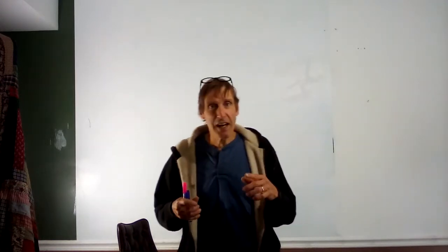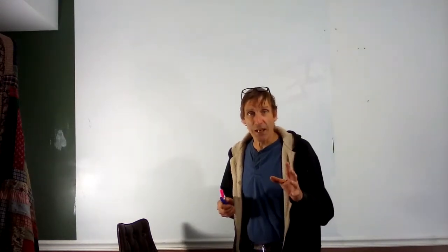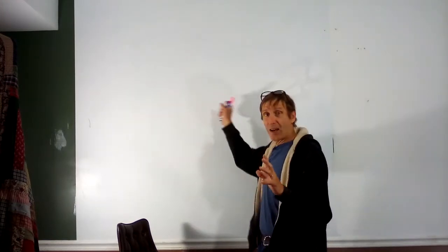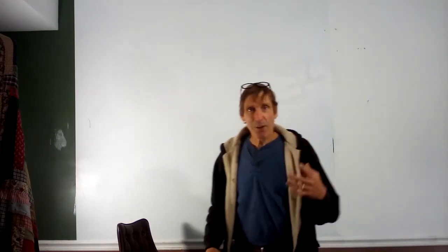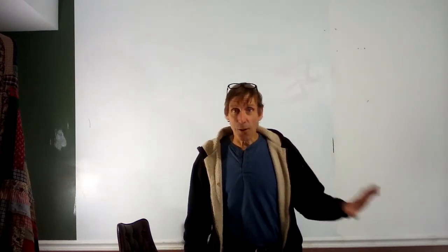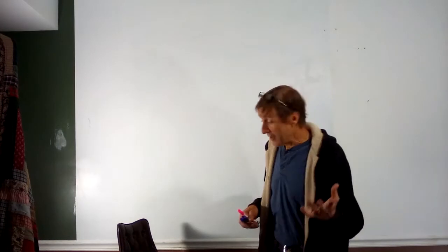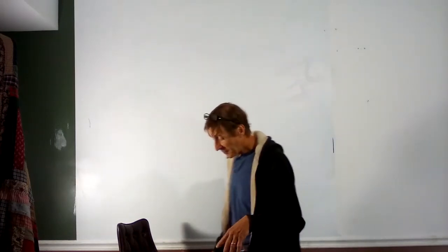Now what I'm going to go over today is the blood cell identification. Normally I do this in lab. What I'm going to do is give you a quick outline on the whiteboard here of how to identify them, and then I'll go through the little PowerPoint that I have with the actual pictures. They're micrographs of the slides we normally use in lab.